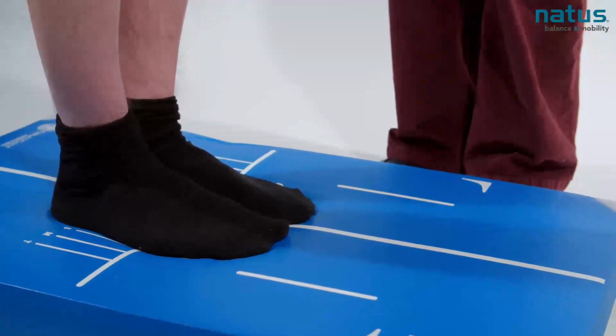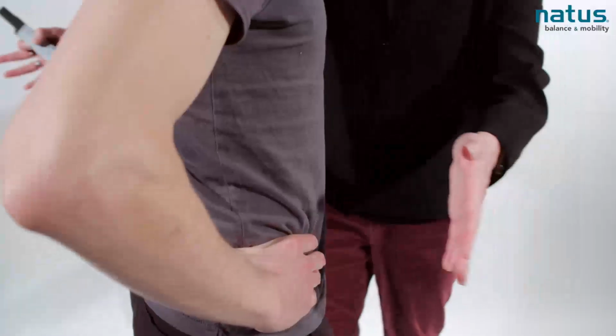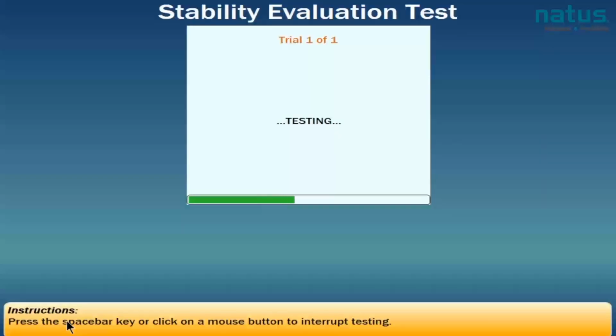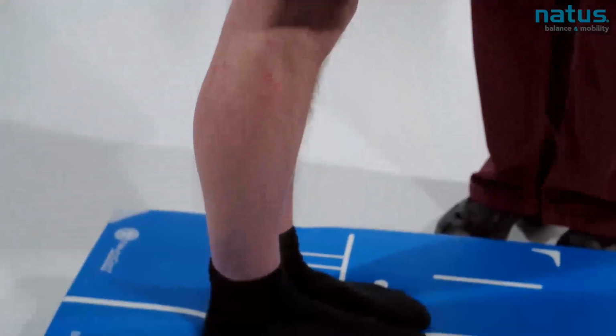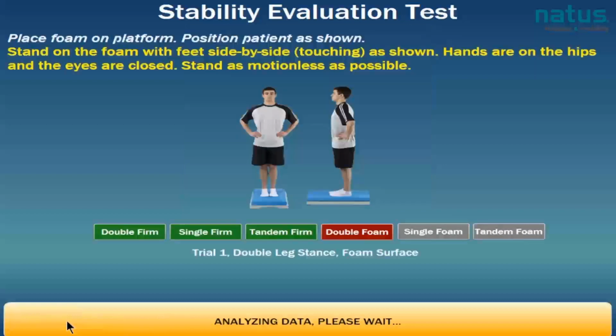Now that we've added the difficulty of the foam pad, I don't expect that he's going to be as stable as he was during the first 3 conditions. Are you ready? Ready. Okay, when you are ready, close your eyes, and I click the start button. And I want to be sure he's safe and stand as motionless as possible. You'll see that he is swaying more than he did on condition 1. This is expected because we've added the difficulty of the foam pad. Almost done, and open your eyes.